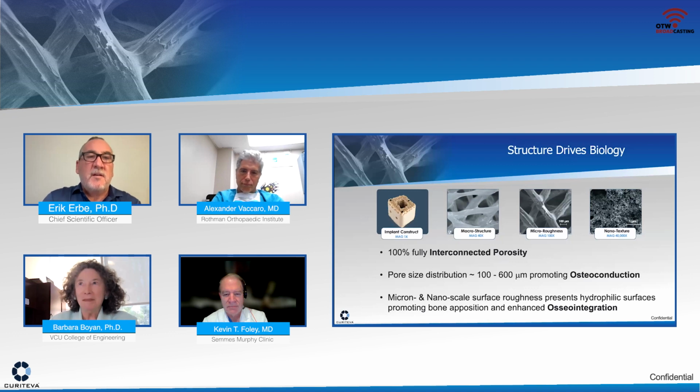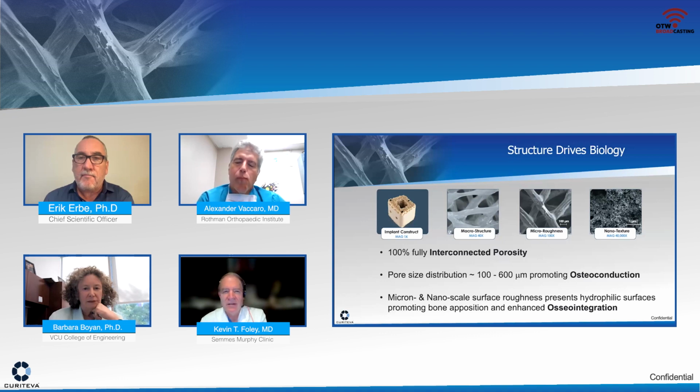Thank you, Barbara. Kevin, if you could comment on your thoughts. Well, you've made PEEK bone friendly, Eric. You know, the knock on PEEK is that it's not bone friendly, right? You're going to have fibrous tissue at the PEEK bone interface, and only grow bone through whatever graft window you have. This material, I think, demonstrates the exact opposite. This material likes bone, and bone seems to like this material.